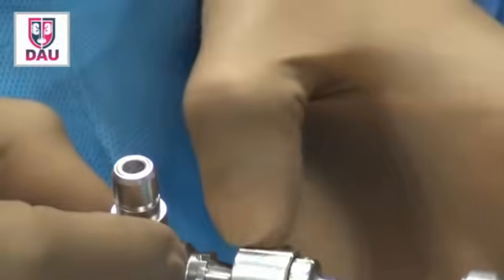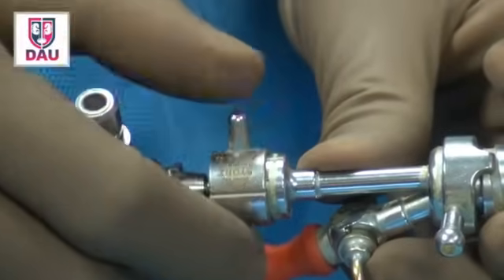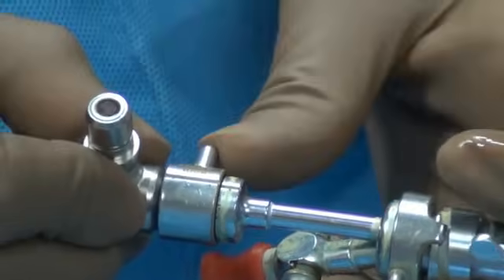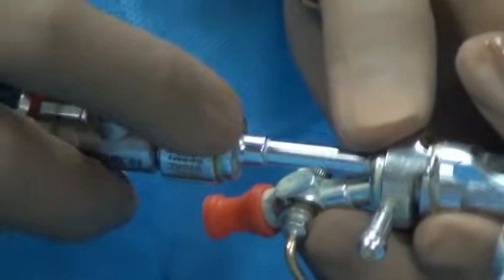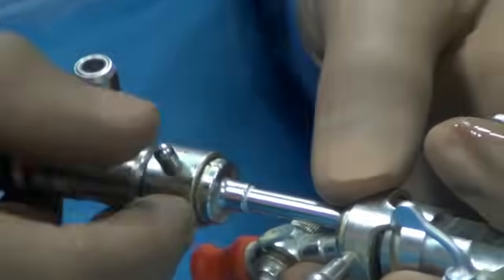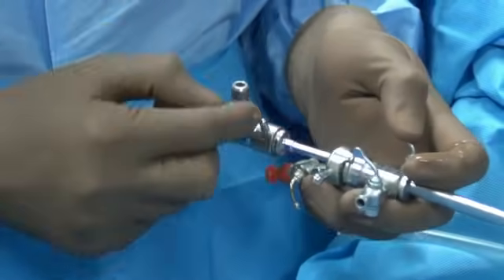As you reach the back end, you will see a cut on the cystoscope and a slit on the bridge — you have to align the cystoscope slit with the bridge slit so they fit together, then lock this. It is very important that you lock it properly, otherwise the cystoscope may disassemble in the middle of the procedure and create confusion. It is vital to lock properly: the bridge to the sheath, and the scope to the bridge.